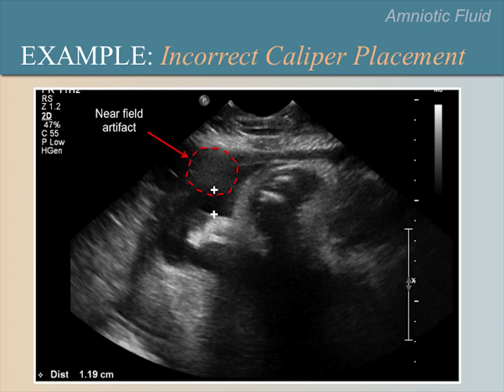The top caliper may have been placed too low because the sonographer confused this near-field artifact with the uterine wall due to similar echogenicity. Here we show the correct location for the top caliper, which was placed by estimating the greatest height of the amniotic fluid pocket from the uterine wall seen just to the right of the top caliper.